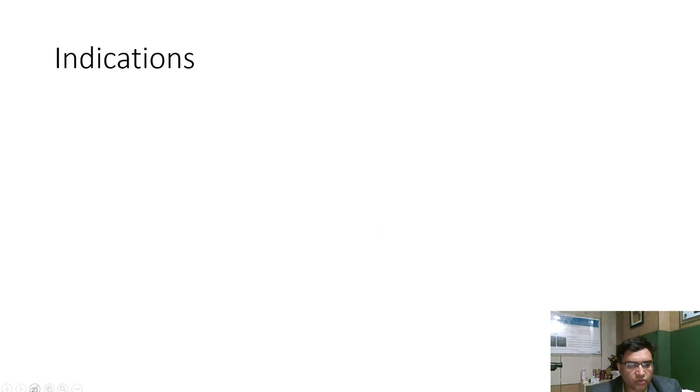Now, the surgical correction which in radial keratotomy could be done only in myopic patients, with the help of microkeratome based LASIK we can use for both myopia as well as hypermetropia. Even in patients who have astigmatism, we can use LASIK.